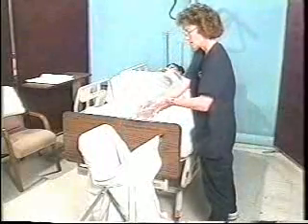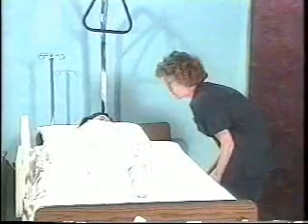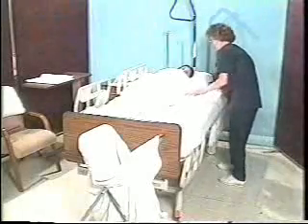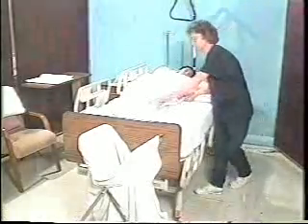Then she discards the soiled gloves and washes her hands after raising the side rail. Next, she puts down the side rail. The mattress pad is then smoothed and the fitted or contour sheet is tucked under the top and bottom corners of the mattress, making sure there are no wrinkles.